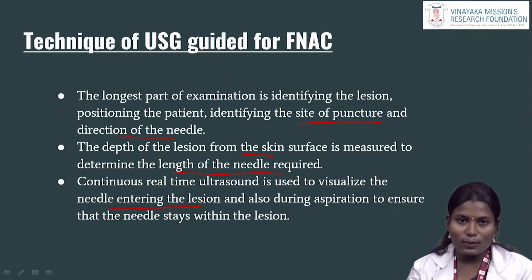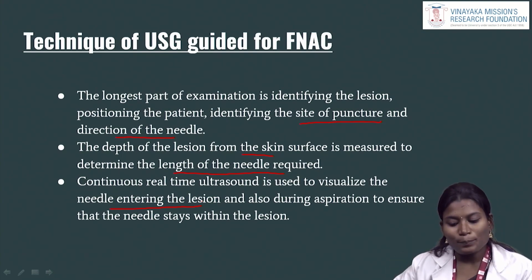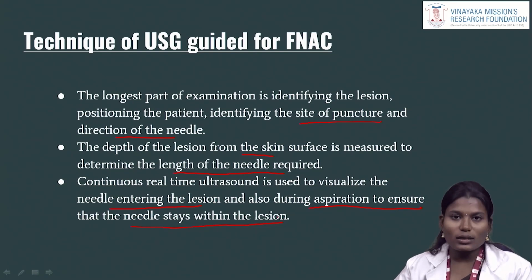When we use ultrasound on the patient's lesion area, we can see how the needle enters the lesion area. Also, during aspiration, to ensure the needle stays within the lesion, we can see that the needle is inside the lesion and whether the location of the puncture site is correct or wrong.